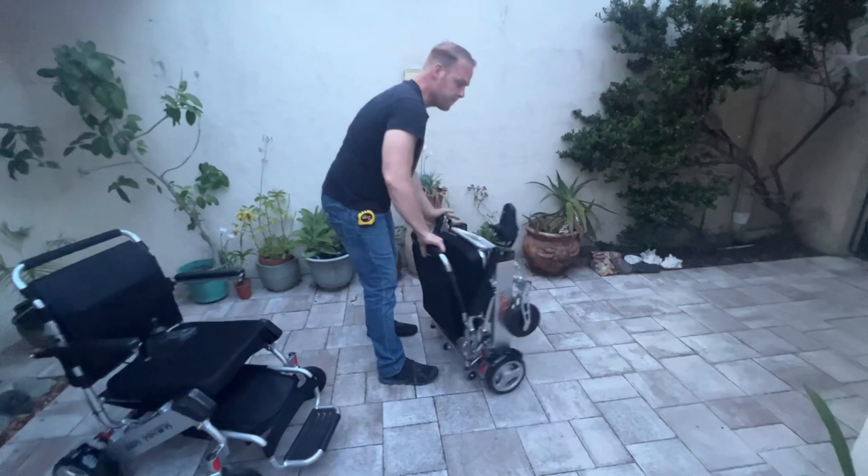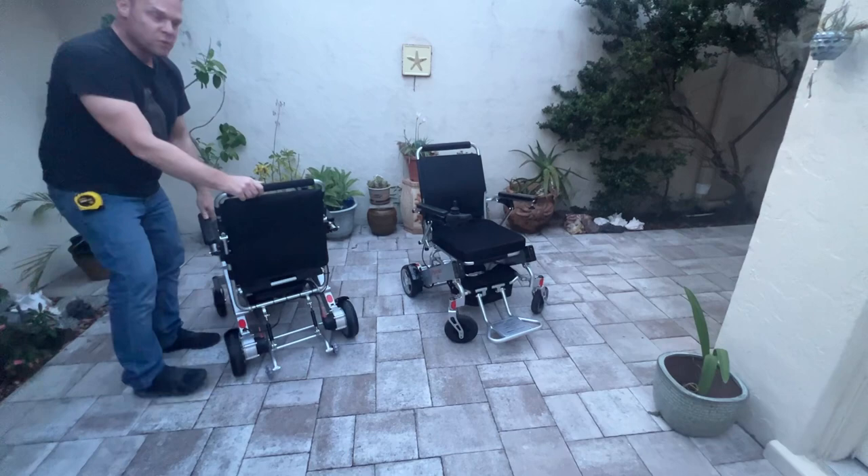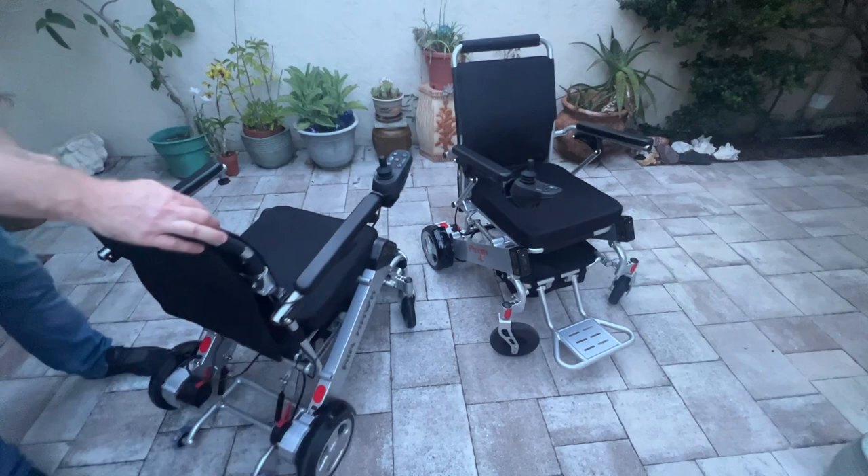Now let's look at the batteries. With the Air Hawk, it operates from one battery at a time, so effectively if you don't want a storage battery, the operating weight can be 46 pounds. The same applies to the Phoenix — you can remove one battery and the chair will still function, adding only an additional four pounds.